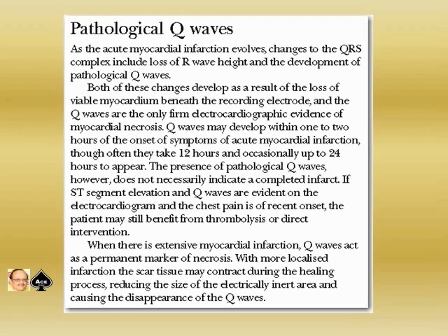Q waves may develop within 1 or 2 hours of the onset of symptoms of the acute myocardial infarction, but often they take 12 hours and occasionally up to 24 hours to appear.